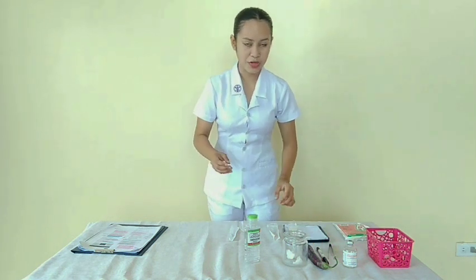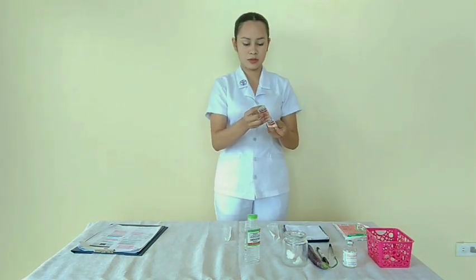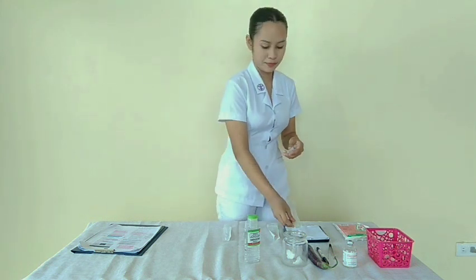Then we're going to take our syringe and remove the cap of the filter needle. Then insert the needle into the center of the ampule.